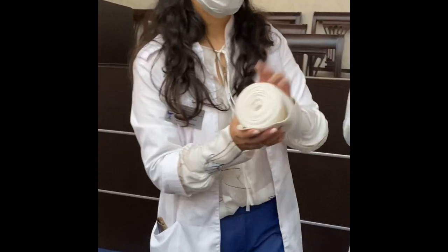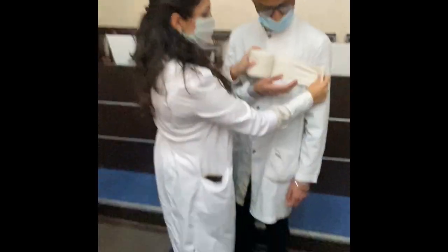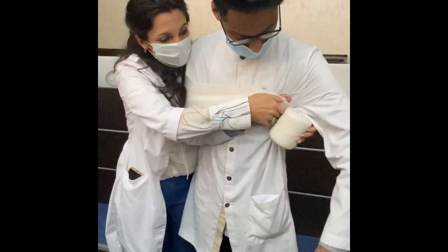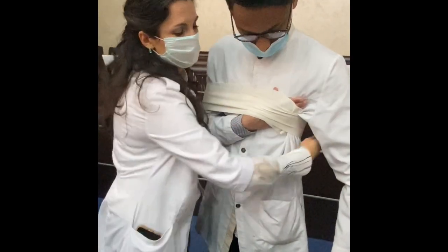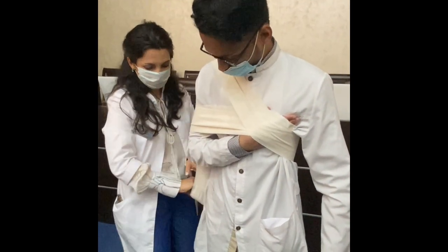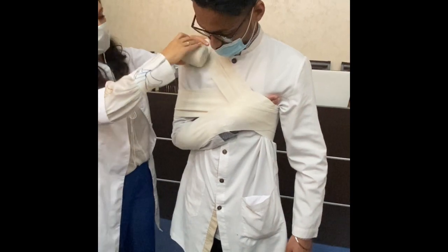We start from the healthy side. Don't forget two fixation layers — circle fixation layers like this. Fix it, then we go to the damaged clavicle. Let's go down, take the elbow, and go — healthy side — exhale, and again up, and again down.